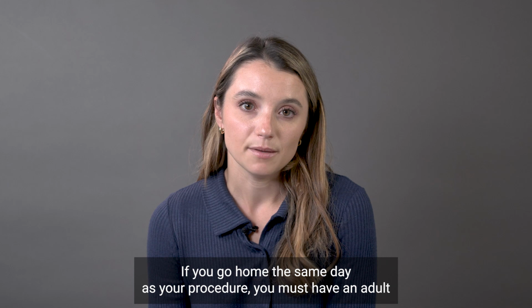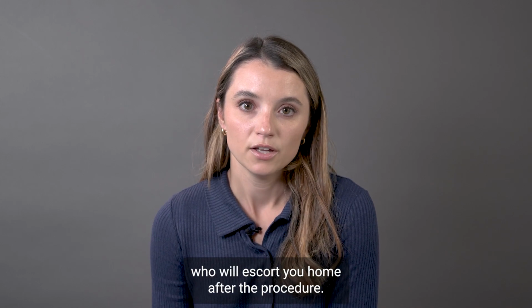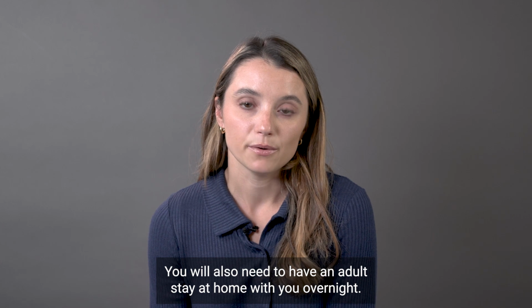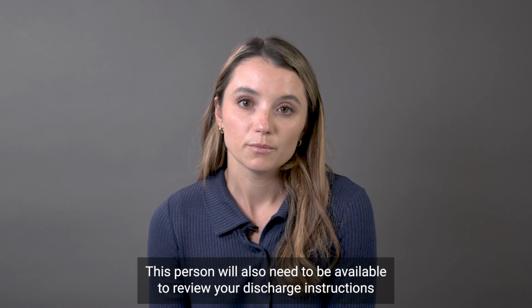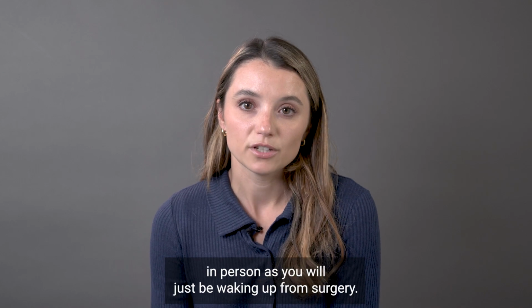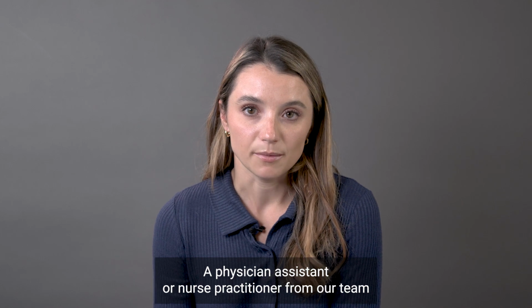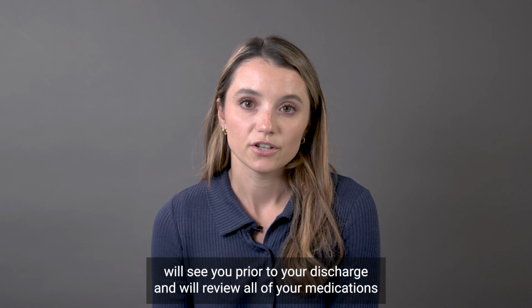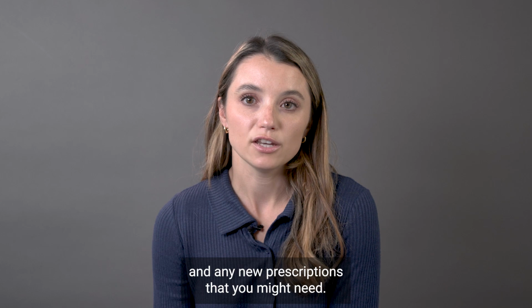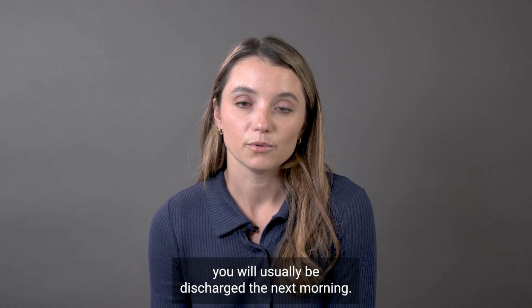If you go home the same day as your procedure, you must have an adult who will escort you home after the procedure. You will also need to have an adult stay with you at home overnight. This person will also need to be available to review your discharge instructions in person, as you will just be waking up from surgery. A physician assistant or nurse practitioner from our team will see you prior to your discharge and will review all of your medications and any new prescriptions that you might need. If you do end up staying overnight in the hospital, you will usually be discharged the next morning.